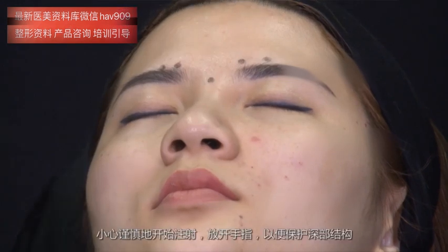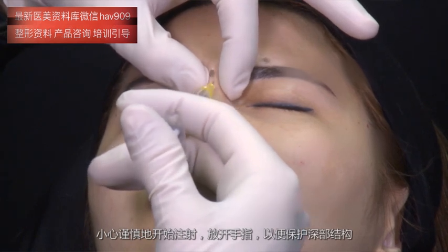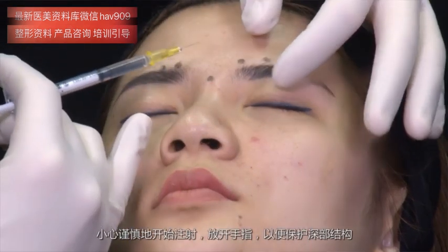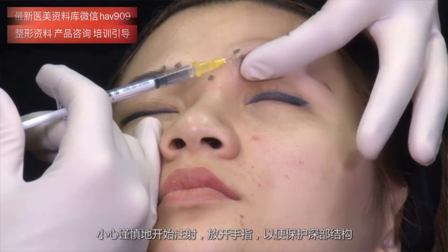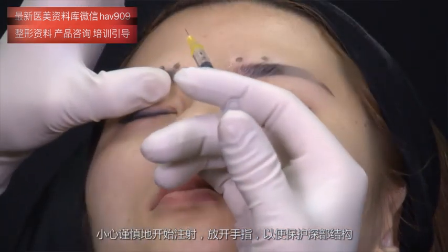Proceed with the injections. And be careful. Release your finger so that you protect the deep structures.